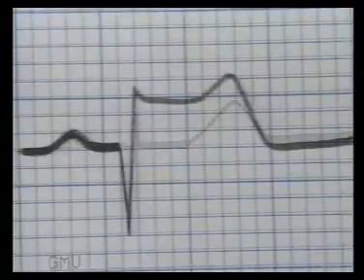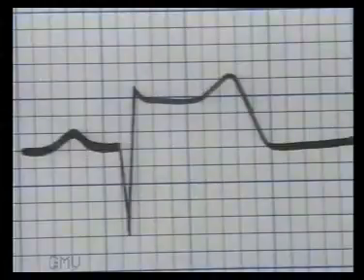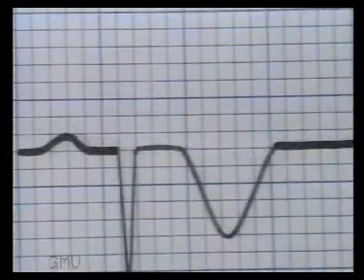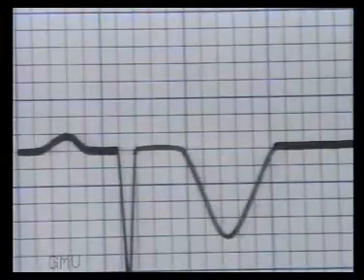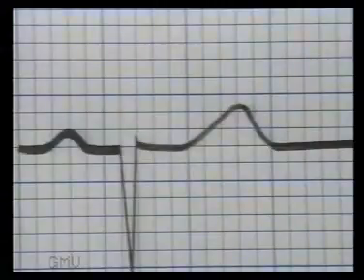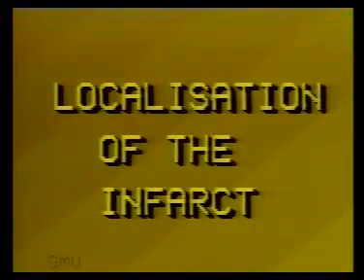This is ST segment elevation with upright T wave on the first day. This is ST segment elevation with inverted T wave during the first week. Now a QS complex is formed with deeply inverted T wave during second and third week. And this is the picture after 3 months where the T wave has become upright and only a deep QS complex persists.